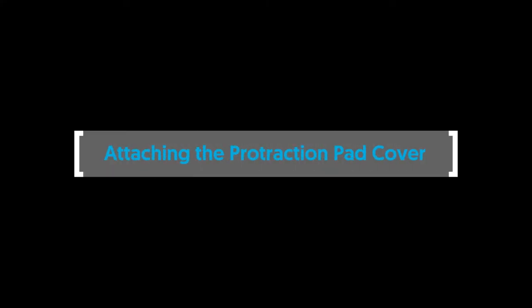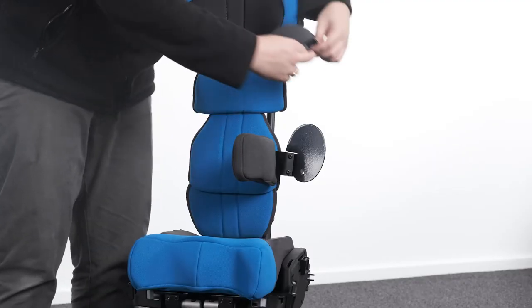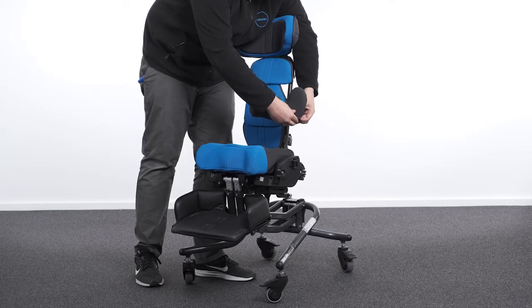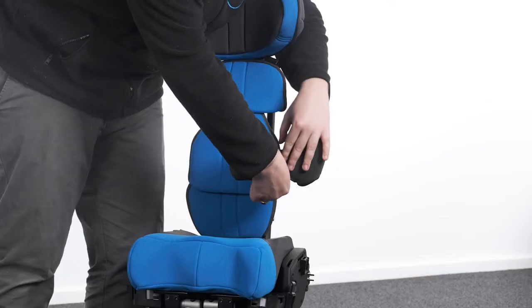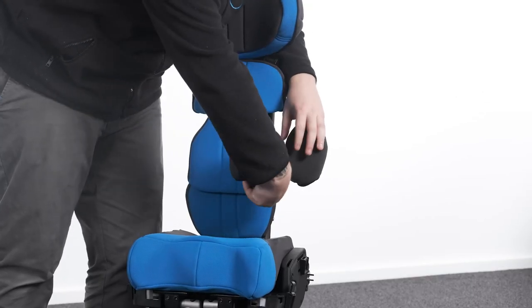Attaching the protraction pad cover. To attach the protraction pad cover, undo the velcro and slide the cover over the platework and insert the extension piece into the lateral cover.